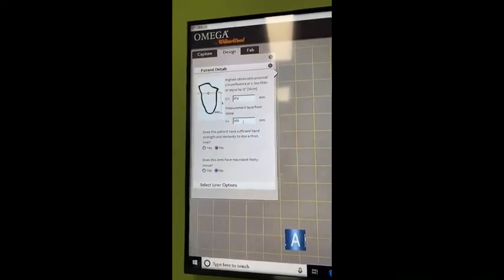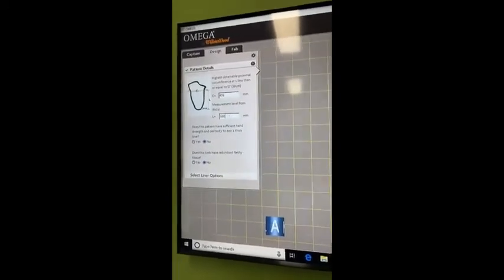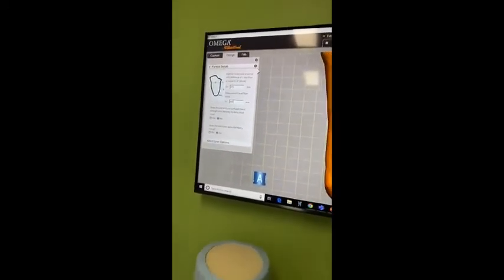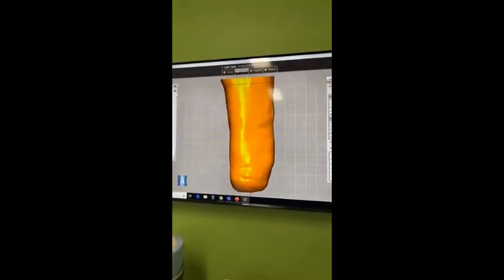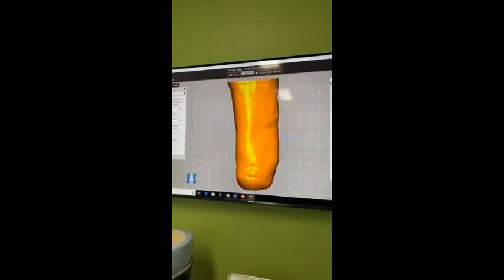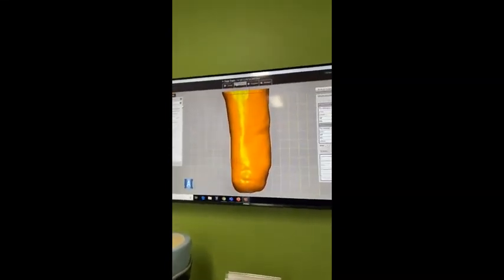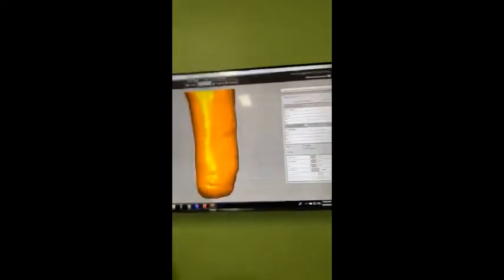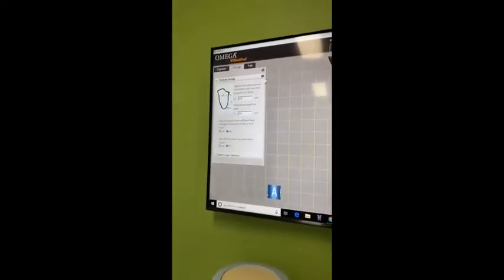So if we change that to 300 and then use that as our circumference measurement, you can find out your circumference measurement by going to the level on the right at 30 centimeters or 300mm, and then putting in your circumference of 472. And then there's some questions here that we've got to answer.